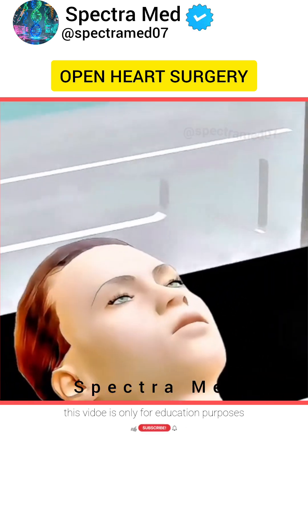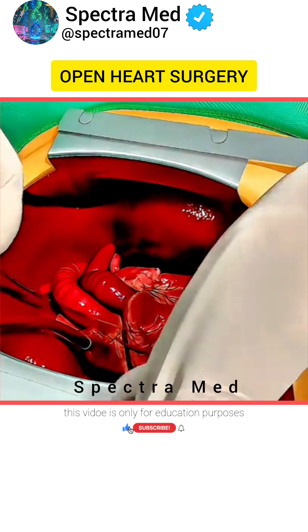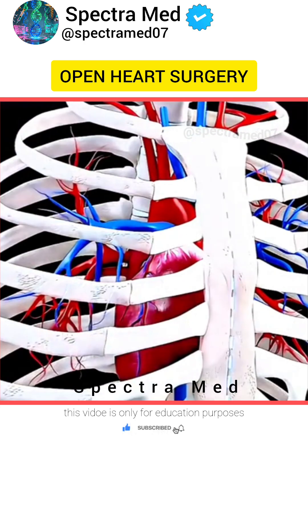First, the patient is placed under general anesthesia and a heart-lung machine takes over to circulate blood. The surgeon makes an incision in the chest and opens the breastbone to reach the heart.